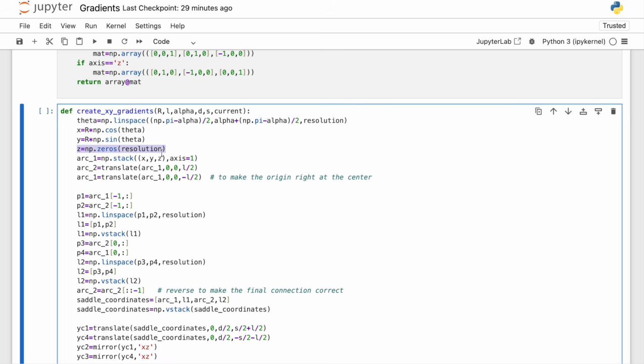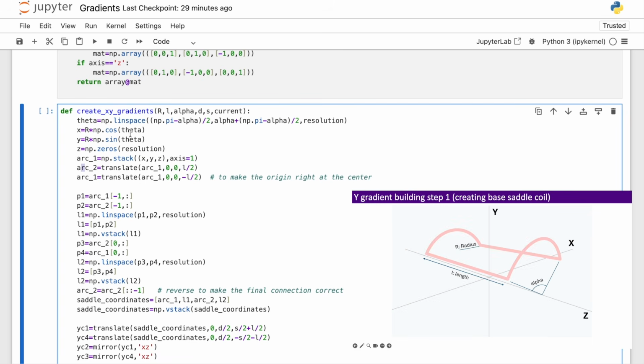That's why the z is 0 at the start. So then we define the first arc, which is by stacking xyz coordinates. Then we define arc 2 by translating arc 1 L over 2 in the z direction, and then we translate arc 1 back from the origin by minus L over 2. So the distance between them would be L.